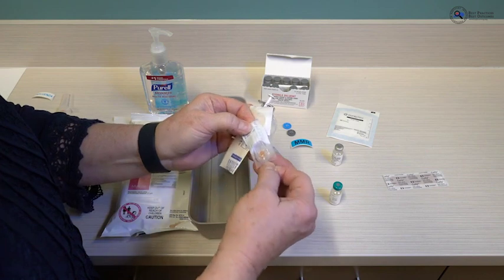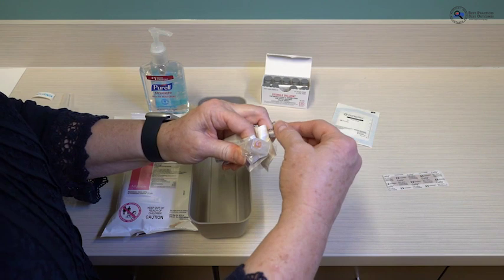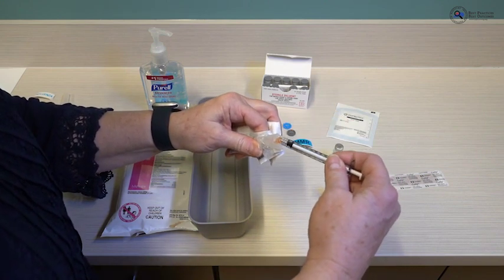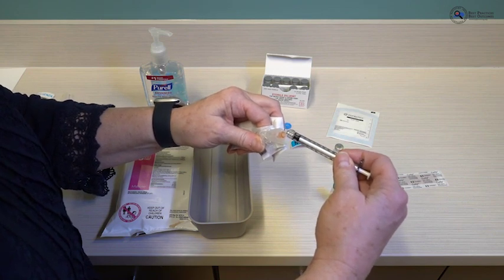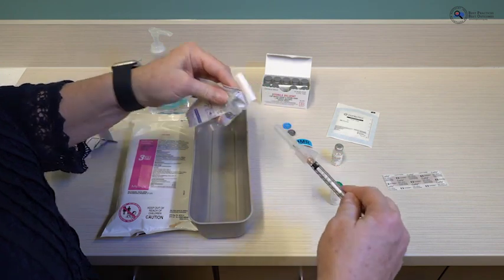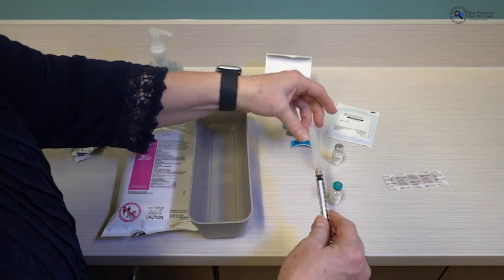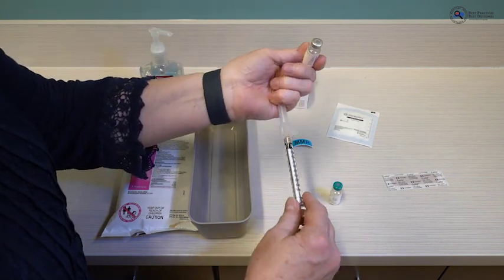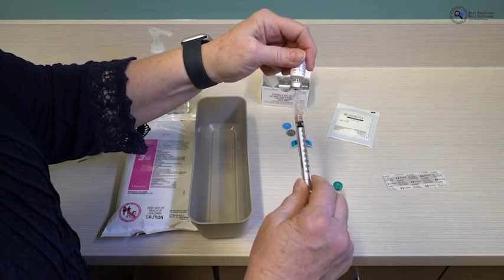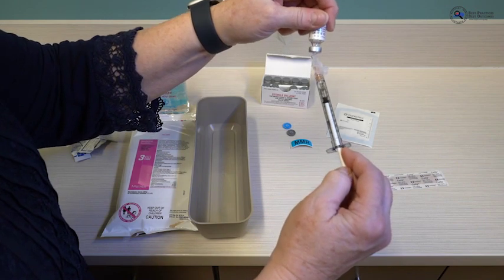For subcutaneous vaccines, we use a very small needle — almost always a 5/8-inch needle — because we are going to the area above the muscle, underneath the skin. Make sure you are observing the no-touch zones and keeping your fingers well away so you can screw the needle and syringe together snugly but not overly tight. Pick up your vial of diluent and withdraw all of the diluent. I usually tip my syringe to the side to pull in all of the diluent.